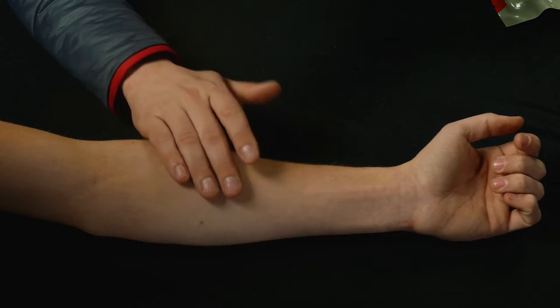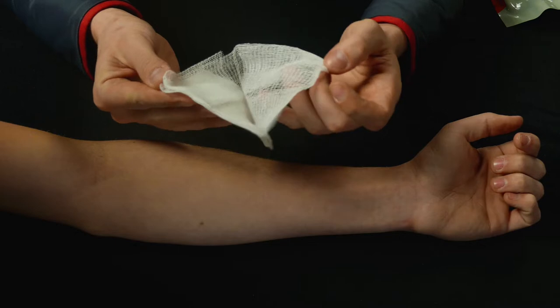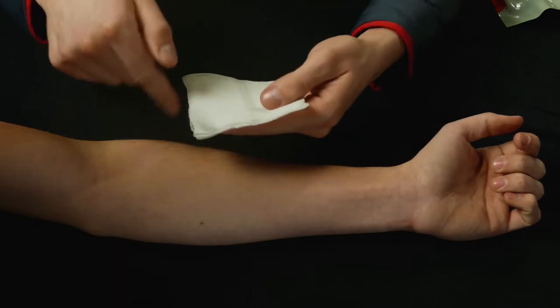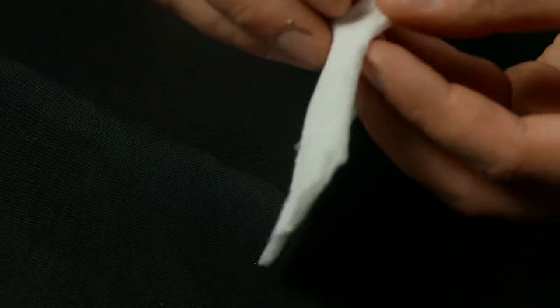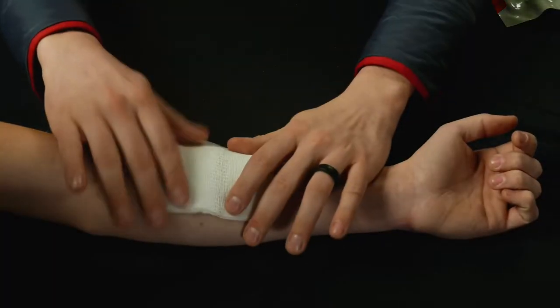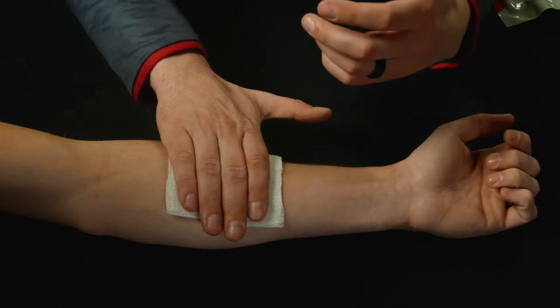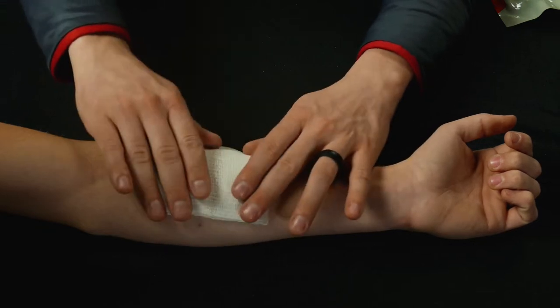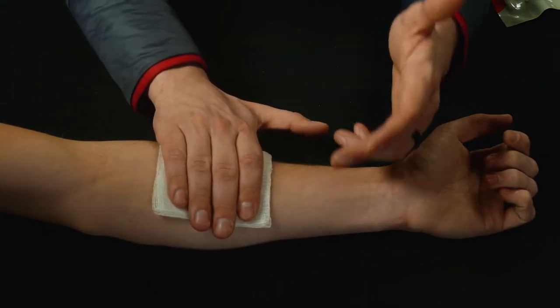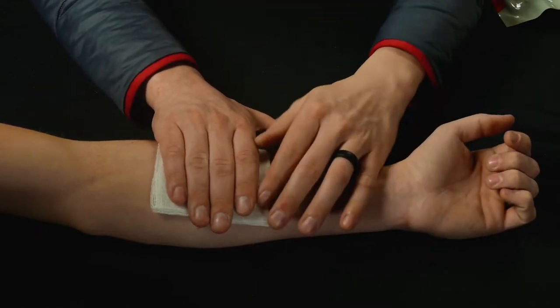If we have an injury, we can take some gauze — I've got a couple of stacked 4x4s here. This is 4x4 gauze because it is four inches by four inches. I'm going to use this as my dressing, dress that wound, and then use a bandage to secure it in place. If we have continual bleeding we may need to hold pressure on this to help that bleeding stop and clot off, so we apply this over the bleeding, hold some pressure, and allow it time to clot.